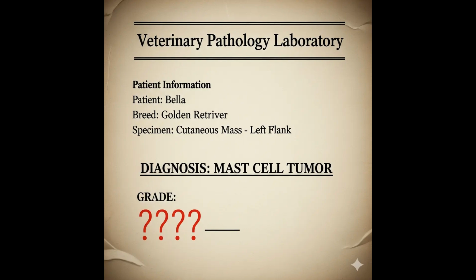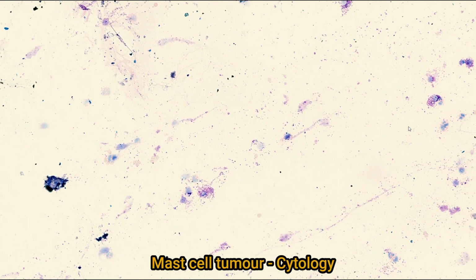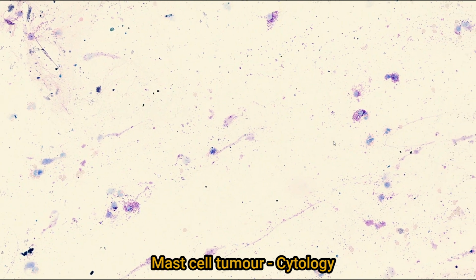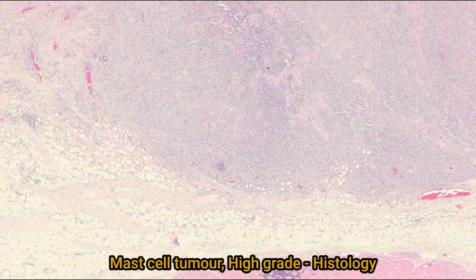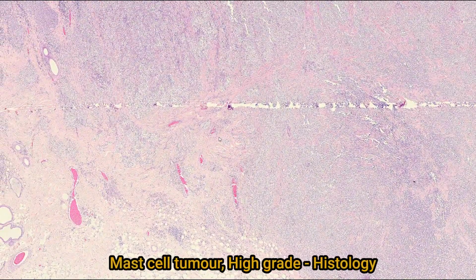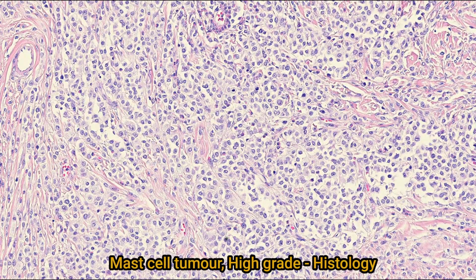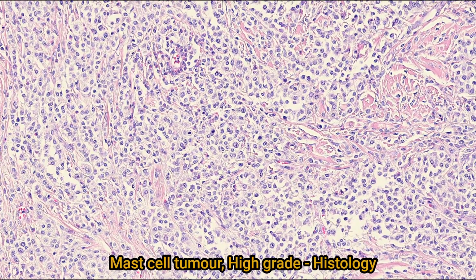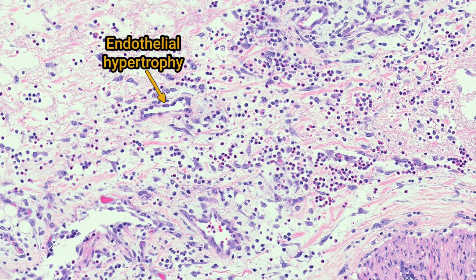To illustrate the critical importance of this architectural context, we can examine a scenario where identifying the cell type alone is not enough for prognosis. Imagine you take a fine needle aspirate from a skin lump and you see a population of neoplastic mast cells. You know what the cells are, but without the architecture, you can't determine the tumor grade, because the grading requires you to see the boundaries and other morphologic features. Are the cells respecting the property line, or are they aggressively infiltrating the underlying muscle and collagen? Cytology is enough to identify the bad bricks, but only histopathology reveals if they're destroying the foundations of the house. Our job is to walk through the house room by room and figure out exactly which system failed.